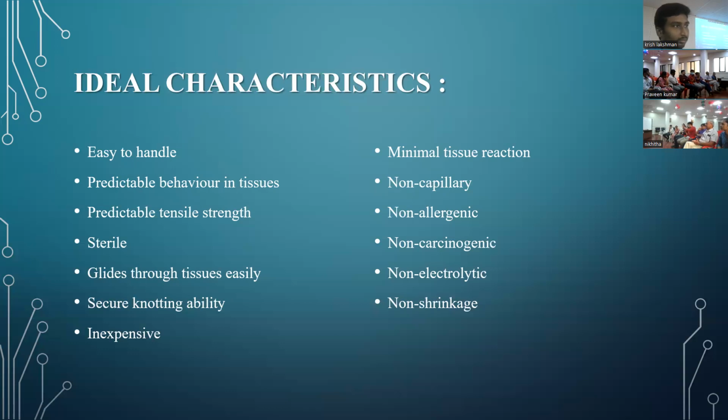If more memory is there, leave a longer length of suture when you cut it. Less memory, you can even cut it just beyond the knot, because you're confident that you will not see that. So there is no ideal length as to how much you are supposed to cut. Short or long, it's all related to the suture material that it is.